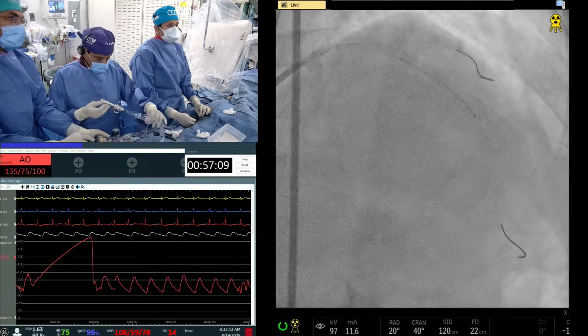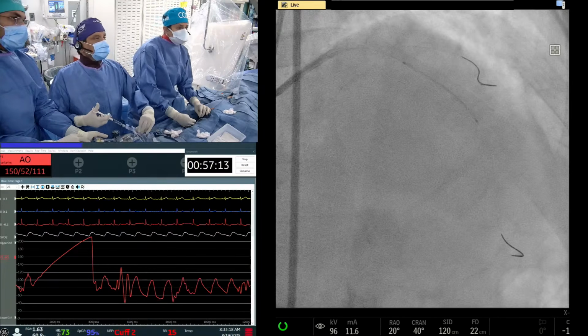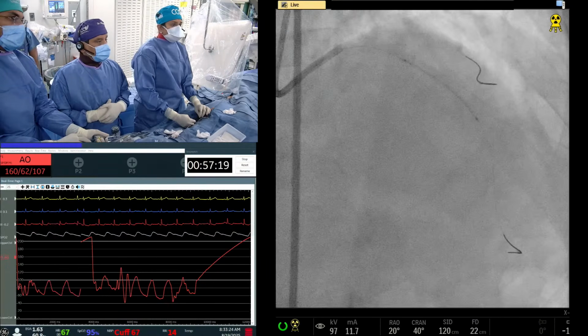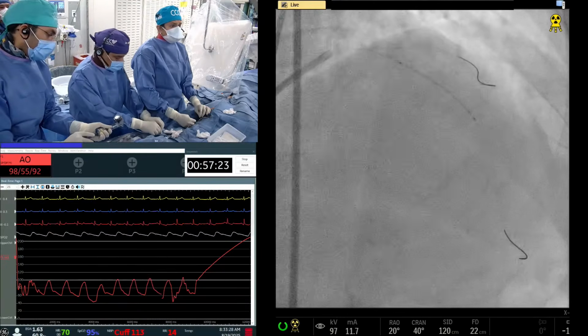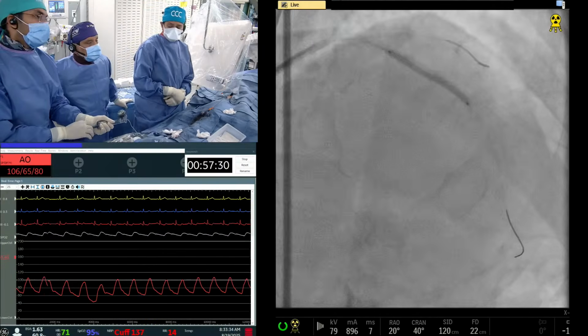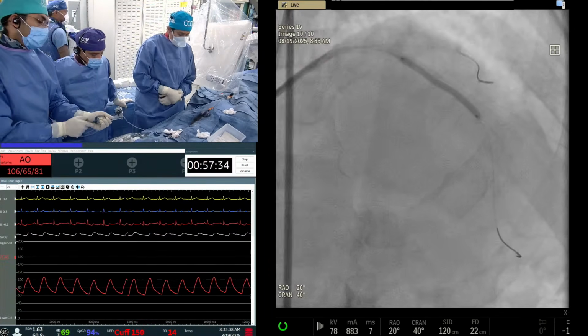Yeah. Good. No, hold on. I'm bringing it back. Two distal, no? There's no space now. There's some dissection now. You see that? Yeah, that's fine. Okay, go up. Go up. Okay, down. Go up again.